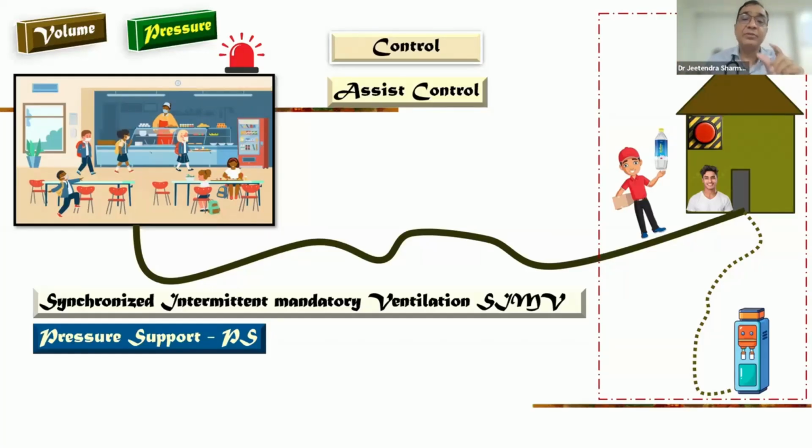But there may be a little bit of risk, so you make a safety feature over there, though it is not part of your mode. You say, if in 6 hours I don't alarm it, then activate my previous plan, assist control. That means 1 liter water keeps on coming. This typical arrangement in pressure support is called backup ventilation. So now you understand this mode also, pressure support with backup ventilation.